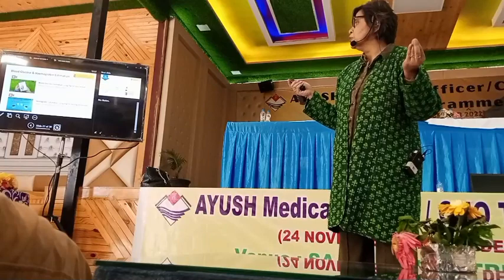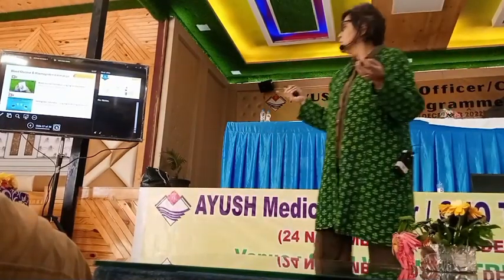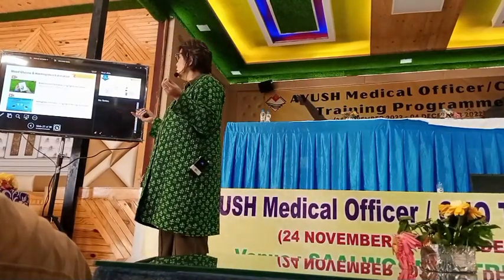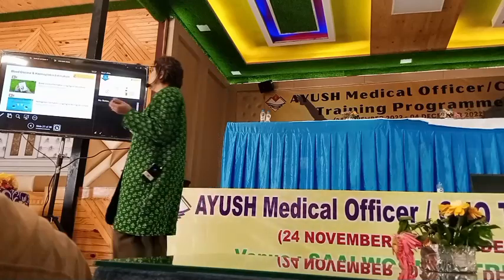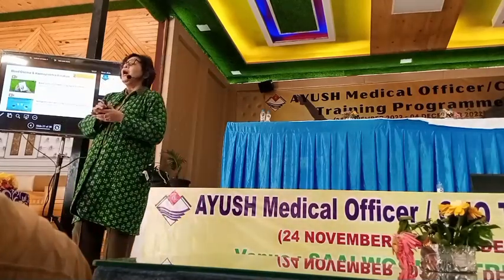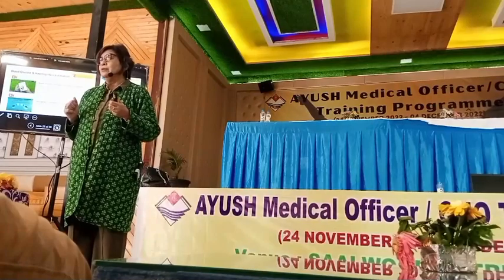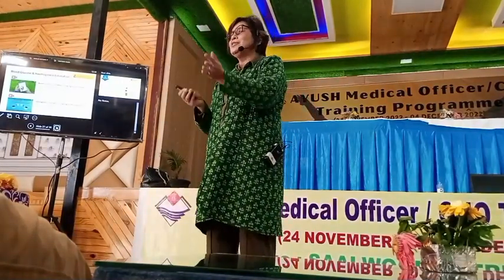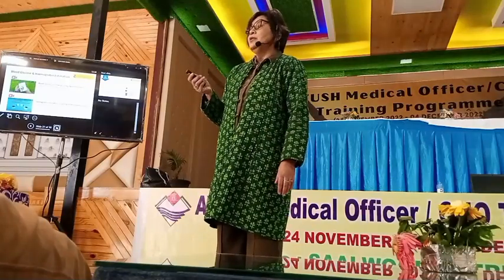Hemoglobin estimation. This is finger prick. आपका ये भी नॉर्मली आप कर सकते हो इसमें। दिस इज अ डिजिटल ग्लूकोमीटर, आई थिंक ऑल ऑफ यू नो ग्लूकोमीटर। I have both Sahli's hemoglobin meter and this digital one in my AyushHWC. Which one is better? डिजिटल इज ऑलवेज बेटर। वो आपने सही डाइल्यूट नहीं किया, फिंगर प्रिक ठीक नहीं किया, तो वो जहाँ पे भी मैनुअल है वहाँ पे डाउट होगा। If you ask me, which one is more accurate?